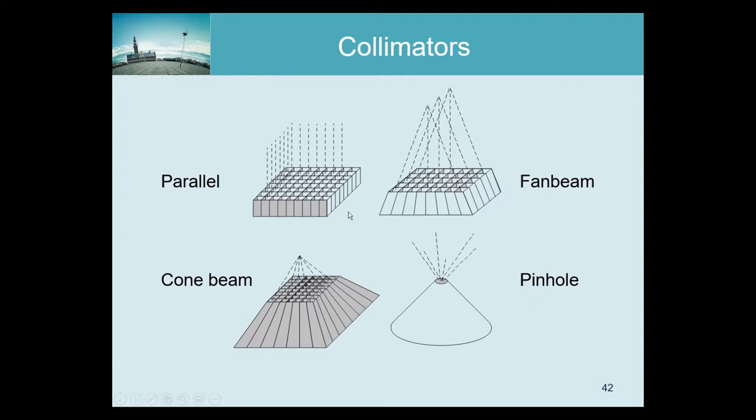More importantly, a gamma camera is human-sized. So if the crystal is half a meter wide, that's about the widest size of our thorax or abdomen. So a human body nicely fits the size of a gamma camera, and therefore a parallel projection of the human body onto the detector makes good use of that detector. And also, it is intuitive. A parallel projection is easy to understand, and gamma cameras are often used for 2D imaging instead of tomography, and interpreting 2D parallel projections is relatively easy.